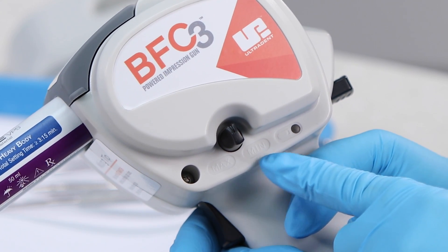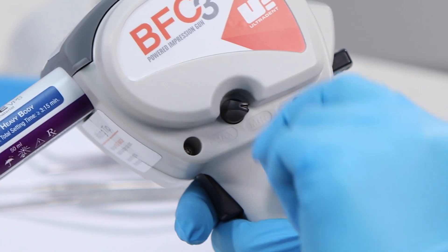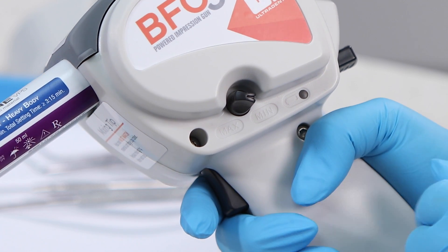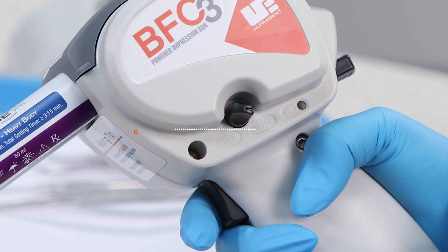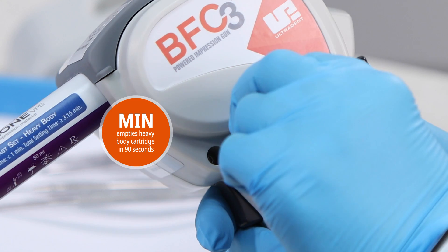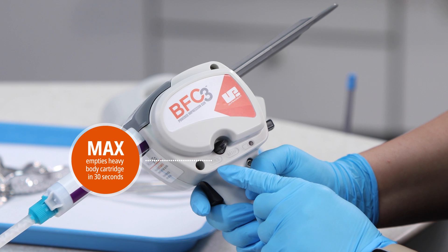Adjust the flow rate by rotating the dispensing speed control between the min and max settings. Ultradent recommends using a slower speed for lighter body materials to improve control. Experiment with different flow rates to find the setting that works best for your practice and procedures. The minimum dispensing speed will empty a 50-milliliter heavy body material cartridge in 90 seconds, while the maximum speed will empty it in 30 seconds.